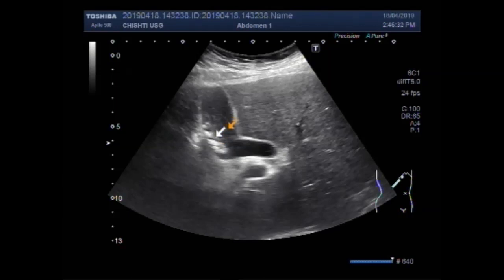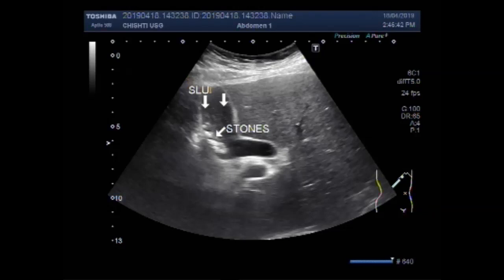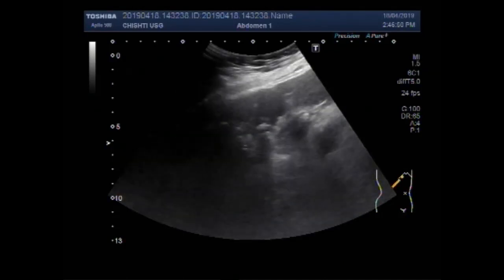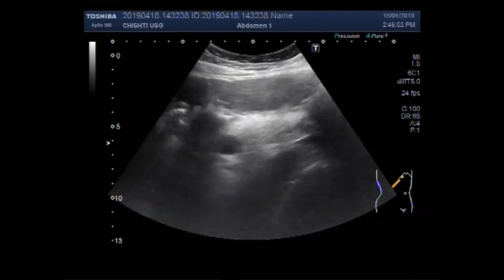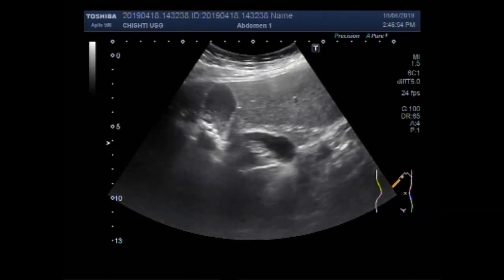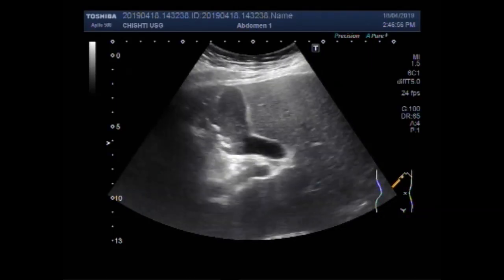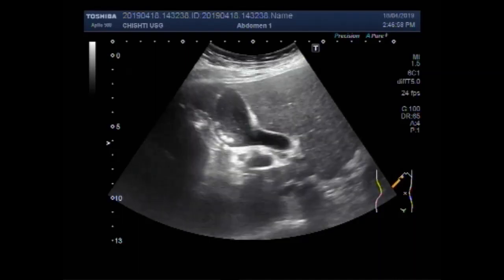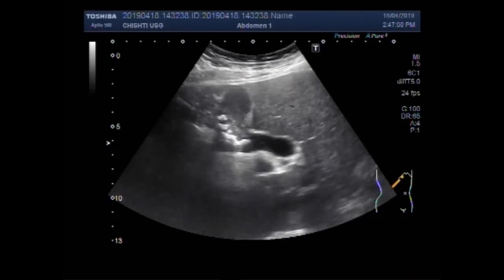These are the gallbladder stones and this is thick sludge seen in the body of the gallbladder. Again, you can see the thick sludge and multiple gallbladder stones.